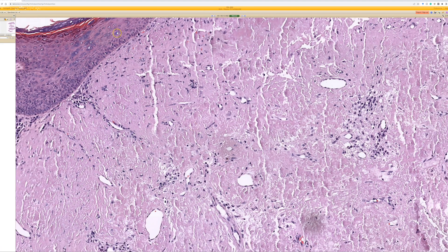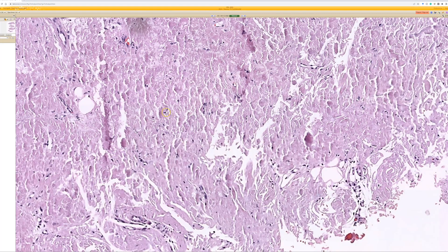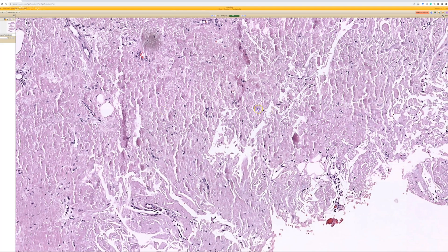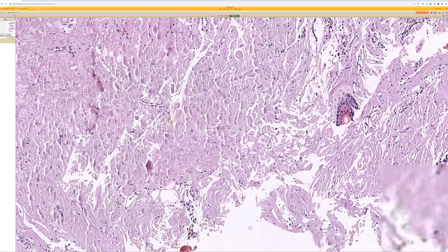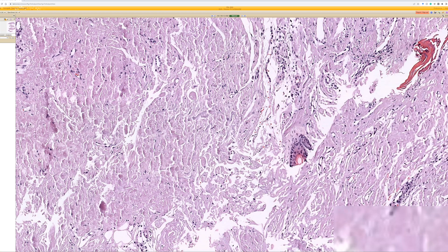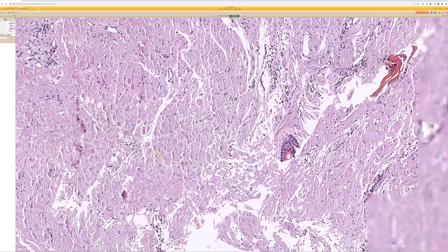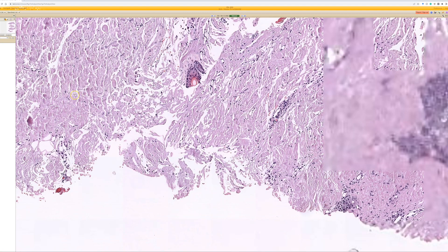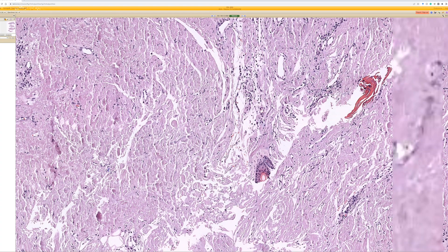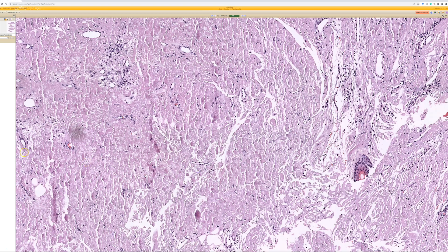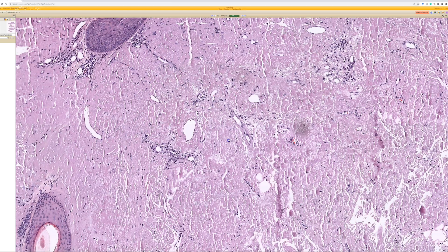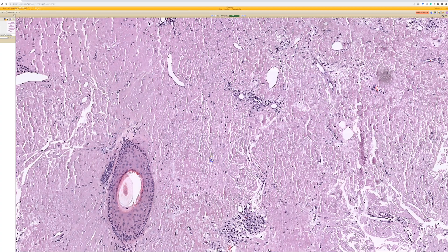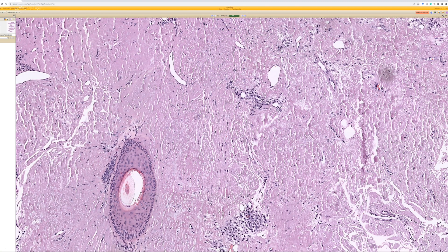In light chain amyloids you get these cracks, but look — it's not just in the papillary dermis; it goes way down and fills up the dermis in this case. Sometimes you get diffuse filling of the dermis in amyloidosis, and sometimes you just get perivascular deposits of amyloid. We've got the cracks but we don't have pigment trapped within them.